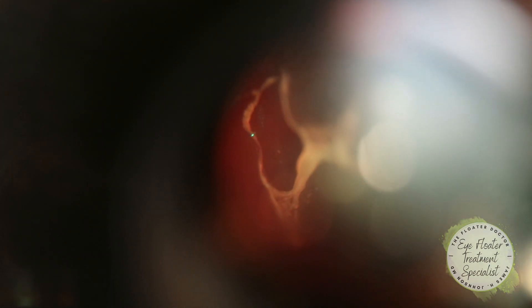The first shot of the laser is a little startling but nothing you'll feel — just a bit of an impact. There's the Weiss ring right there — that opening — but it's relatively small compared to all the other stuff associated with it. We're going to see what we can do. The good news is he has really clean optics: the cornea is clear, the lens is clear, nice big pupil.